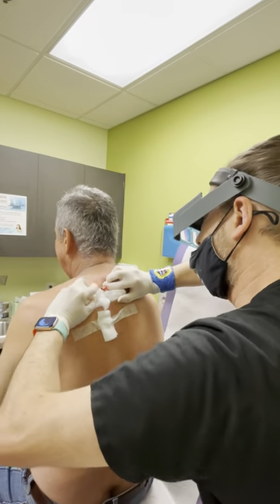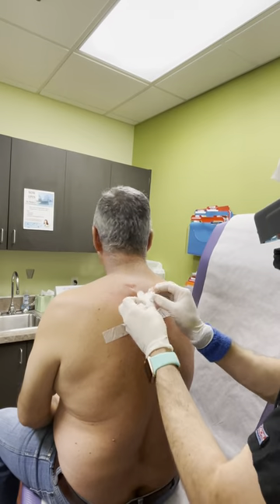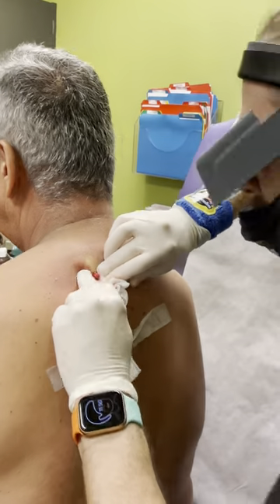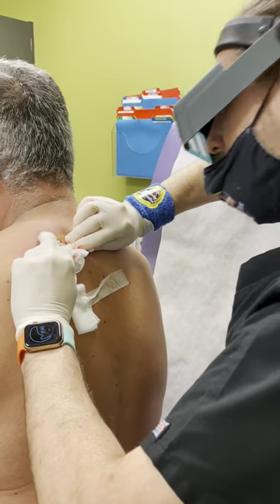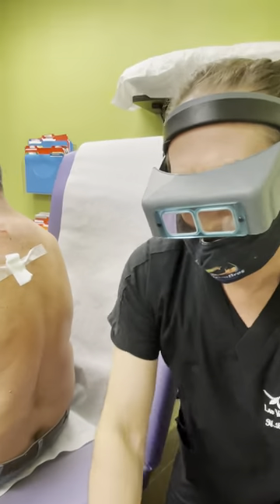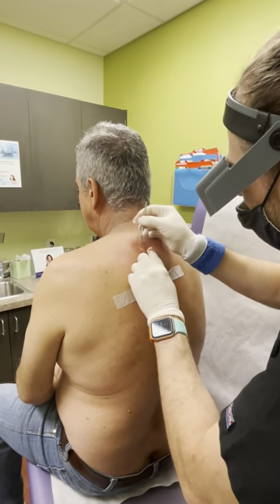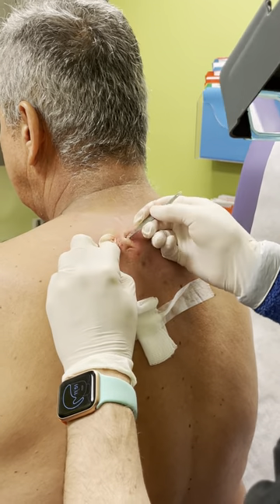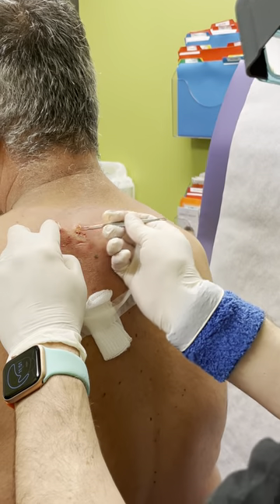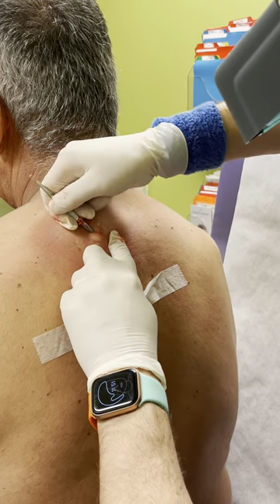He said you can put more pressure. It's not hurting. Well, I don't have any more muscle — that's all I got. Let's see if there's any more in there. Ultimately you will have to remove the cyst and the sack, but this will relieve the pressure. It'll make his back look normal. I think long term he'll be happy having done what he did today.